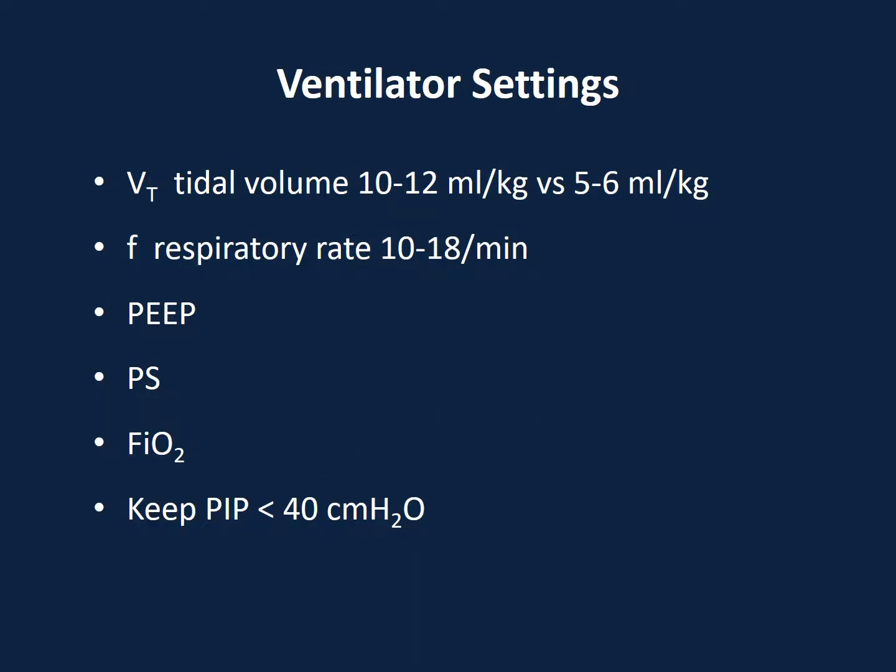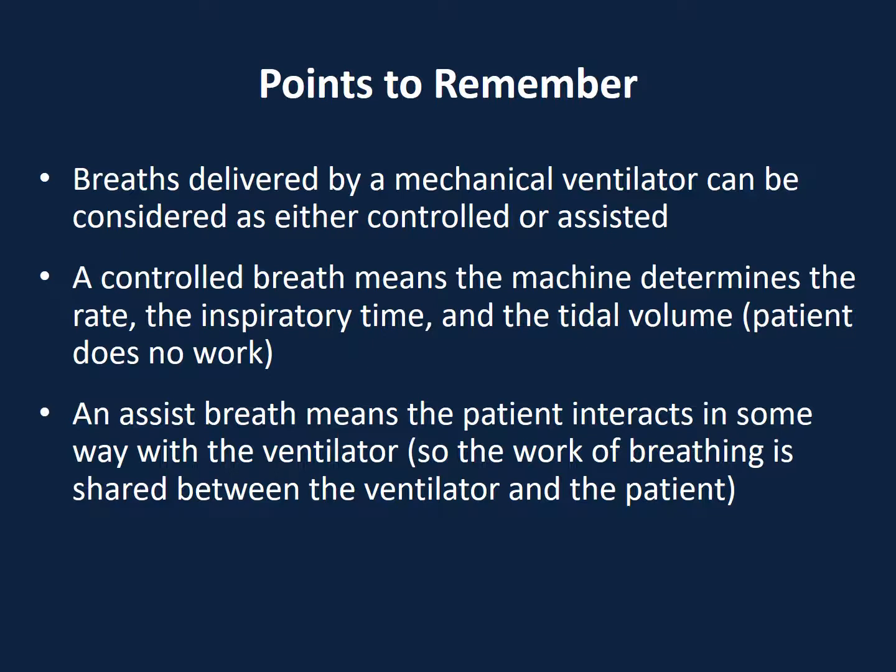These are some of the settings that the clinician will put in. Don't worry, you're not the one going to do it. Physiotherapists won't deal with ventilatory settings. It's always the respiratory therapist or the clinician or the trainers. So some points to remember.